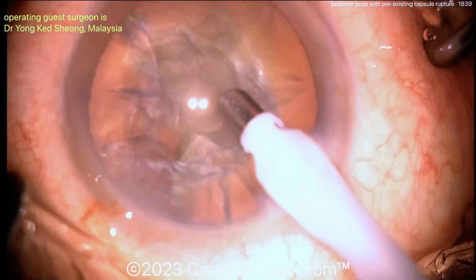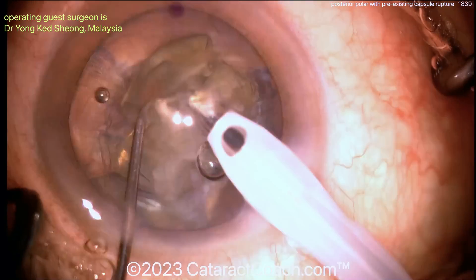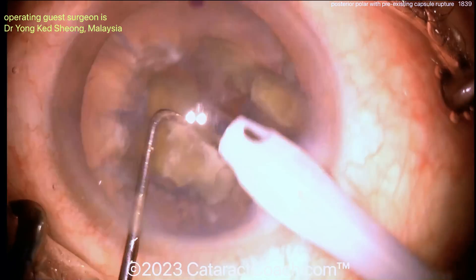Good use of viscoelastic — very smart. Now getting the other half of the nucleus up. Bring it up, and you can just emulsify it. No need to even sub-chop it. Bringing it up — if you'd like to chop it, fine — but bring it up to that iris plane and emulsify it.